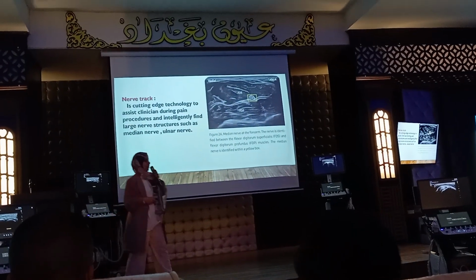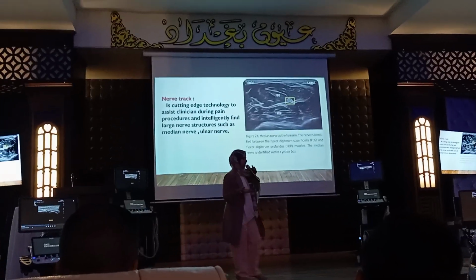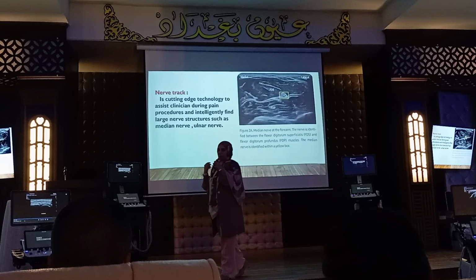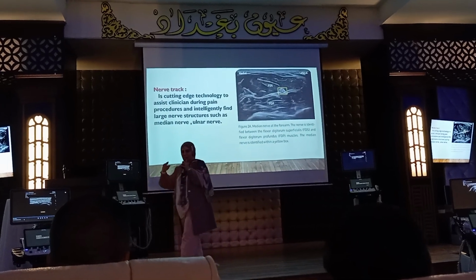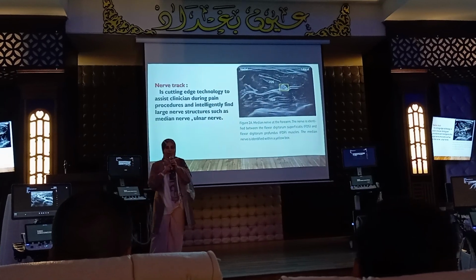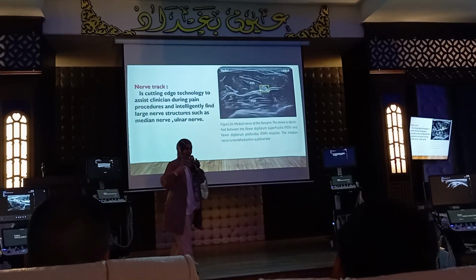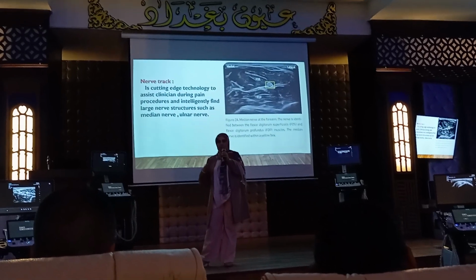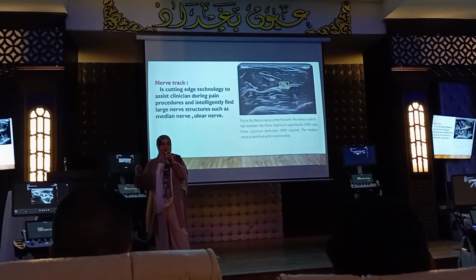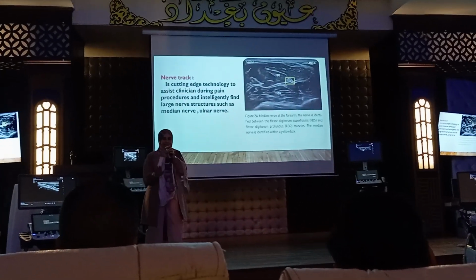We have a new technology in nerves, for how to see the nerve. Previously, it was very difficult to see the nerve. Sometimes when we do injection, we can't see the nerve, so we place the needle just beside it by doing stimulation, because in the radiofrequency equipment we have sensory stimuli and motor stimuli. So we give hertz, for example 50 hertz, and do stimulation. So the patient's muscle will be vibrating. So that's okay, you are in the nerve, you are beside the nerve.